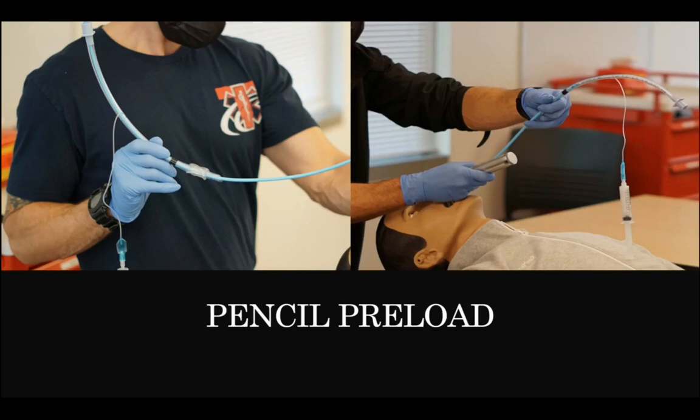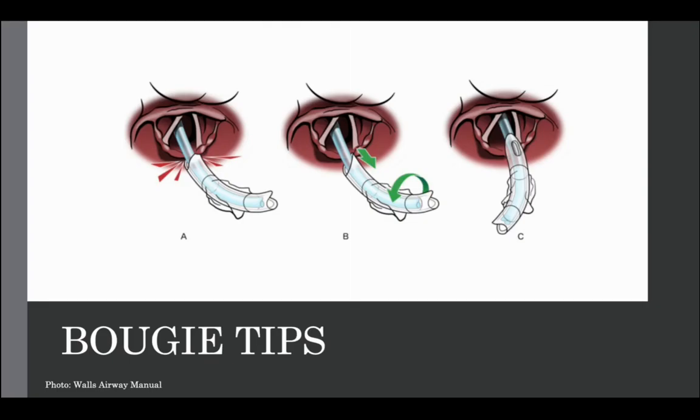Pencil grip preload is another way to do it, but we need to be really careful that we pinch the tube nice and firmly so that the bougie doesn't slide backwards through the pencil grip. But both of the preloads make this a little easier to do if you don't have a partner who's very experienced. But they do both have sort of ups and downs for them.